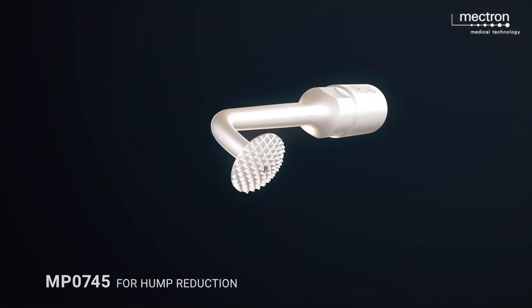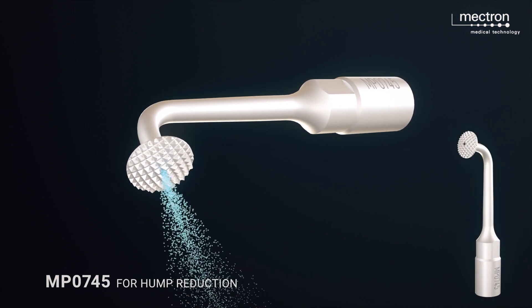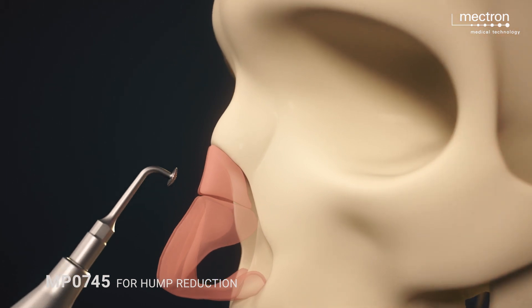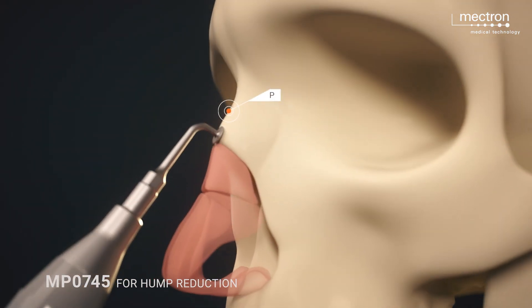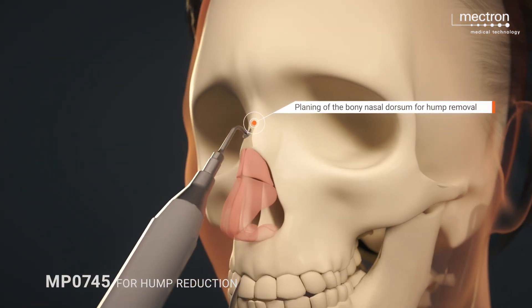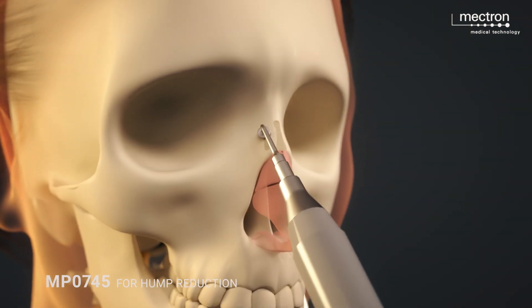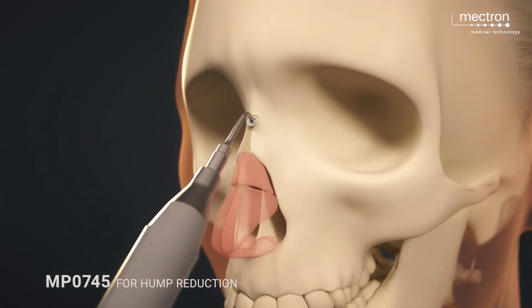Special inserts such as MP0745 are ideal for the precisely controllable reduction of a hump on the bridge of the nose. Widened bones of the side walls can also be elegantly narrowed and planed with it.